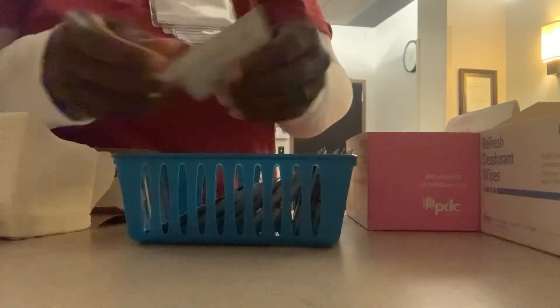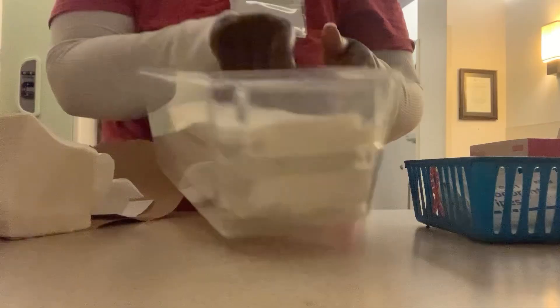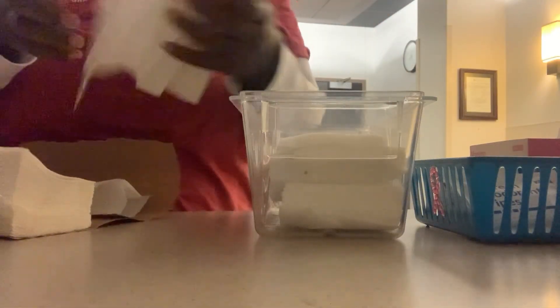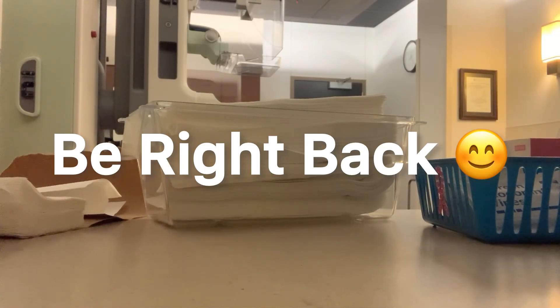I'm stocking the supplies and getting everything ready for the day. I make sure we have wipes available when patients come in. The next thing I do is stock the paper towels we use to help clean the machine, so I don't have to rush out and grab them later. I also need to go grab my alcohol bottle — I forgot it, so I'm going to do that now.